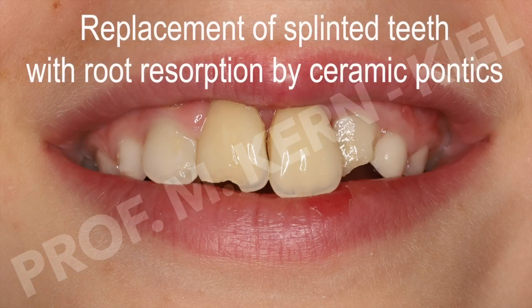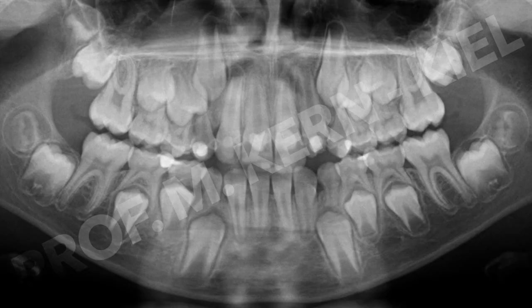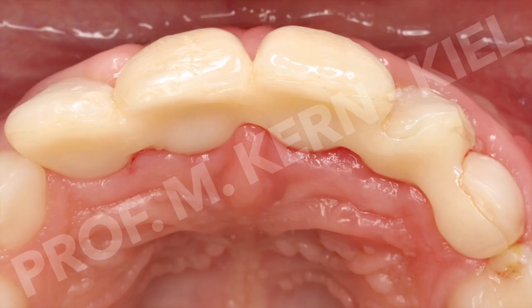After an accident involving an 8-year-old patient, the dislocated central incisors were re-implanted and stabilized using a CTS splint. After endodontic treatment of the upper incisors, an adhesive splint made of high-strength zirconia ceramic was inserted to ensure the preservation of the fragile teeth.